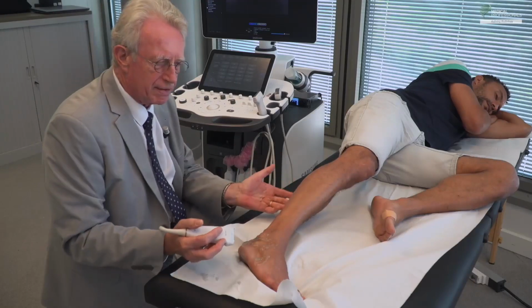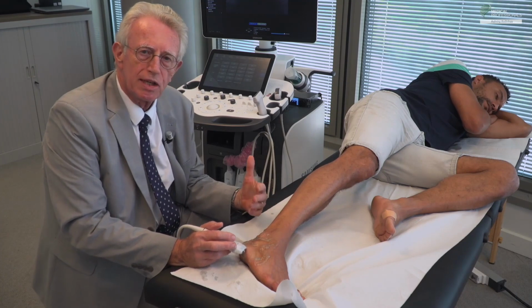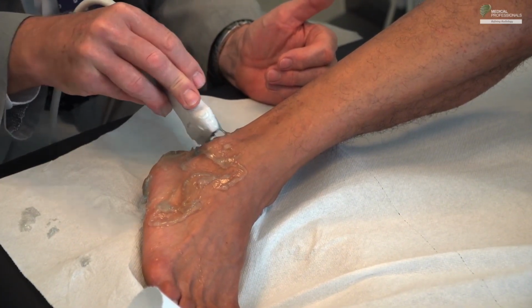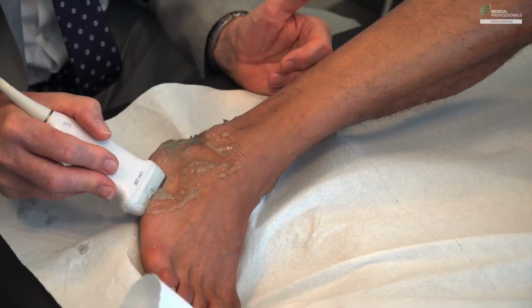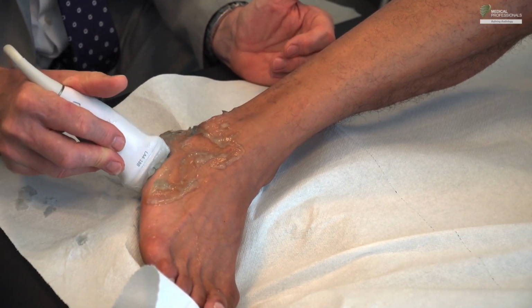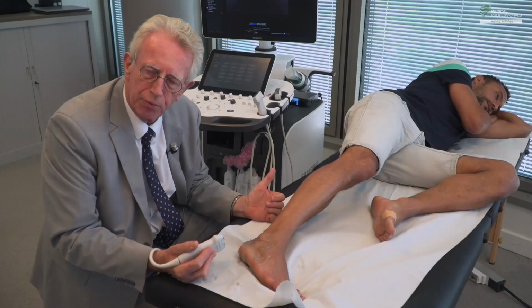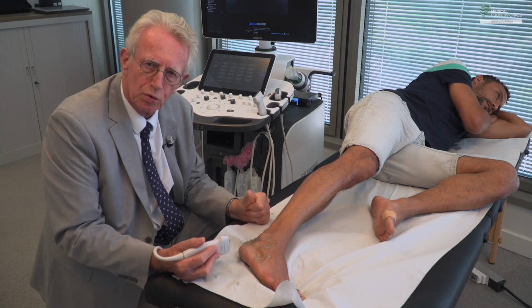So when a patient comes in stating that they have pain on the side of their ankle, if it is outside the context of a sprain, it is necessary to look at the peroneal tendons, the superior retinaculum of the peroneal, the inferior retinaculum of the peroneal, the insertion of the peroneus brevis on the base of the fifth metatarsal, and the peroneus longus as it passes over the cuboid. We also look at the sinus tarsi to see if there is an effusion at this level, or even a cyst, because the subtalar joint leads to the formation of many cysts.